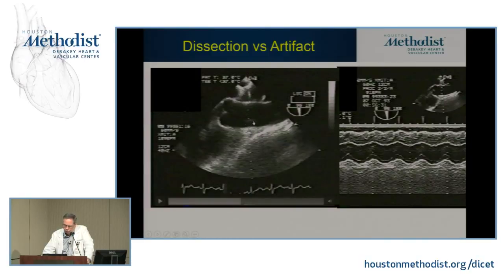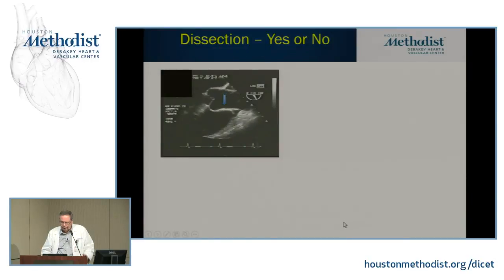Of course, the other thing is that you don't see it spreading. If you put color flow, you won't see any false lumens. I mean, there's many other things you can do. But one quick maneuver is just to throw an M-mode there and show that it's moving parallel, whereas the flap has a whole different ballgame.